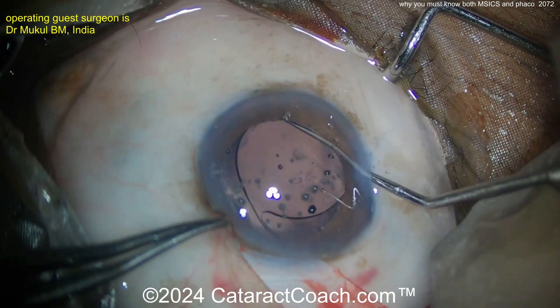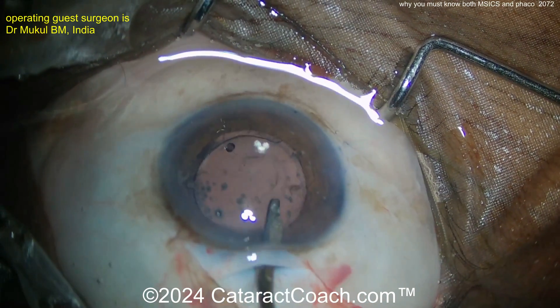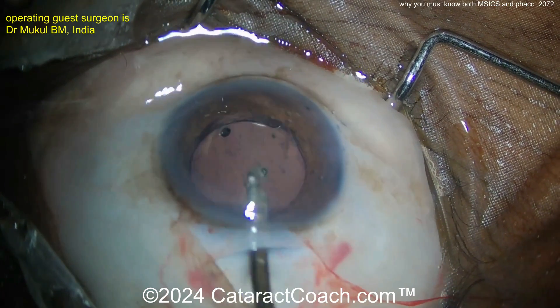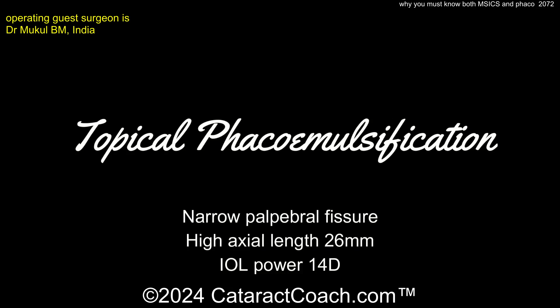There's going to be some astigmatic effect from this incision, especially if you don't suture it, but you can take that into account for your patient. You can make your incision on the steep axis if they already have a diopter or more of corneal astigmatism, and that can help.